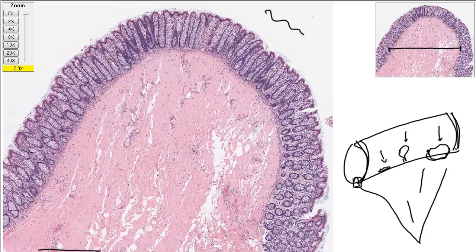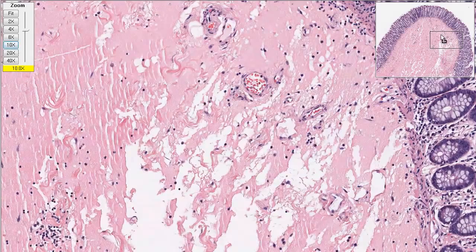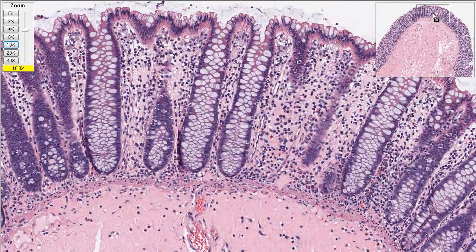Okay. So now to drive around, what you'll see is you'll begin to see me driving around with this arrow, and these are the controls for the program for zooming in and out. If I'm going to zoom in and out, you can see I click on something, and we'll be able to look at something more closely. That's amazing.